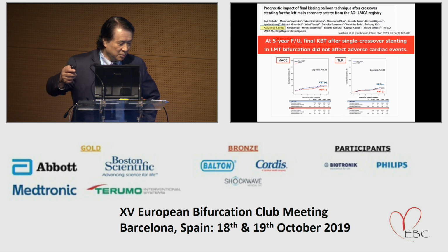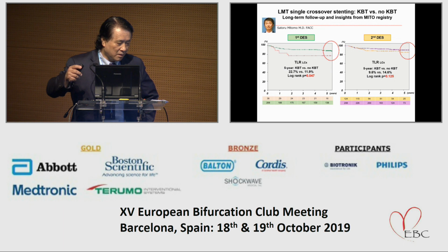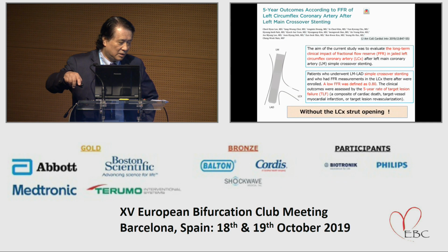Anyway, they reported final kissing balloon after single stenting of left main bifurcation lesion did not affect adverse cardiac events. And this morning, my junior reported on left main single crossover stenting, kissing balloon or not. Actually, in the era of the second generation DES, actually no difference. And finally, a very important paper, I love it actually, from Korea.